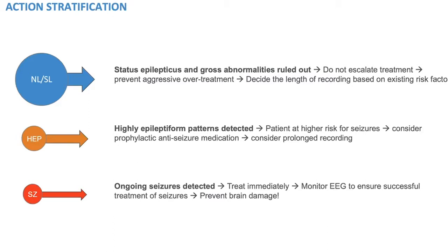Dr. John Stern, as many of you know, has authored several EEG atlases and is very well known in the domain of EEG interpretation. I hope that you will enjoy this conversation, and you will see we have some tricks to teach you as to how to read Ceribell EEG.